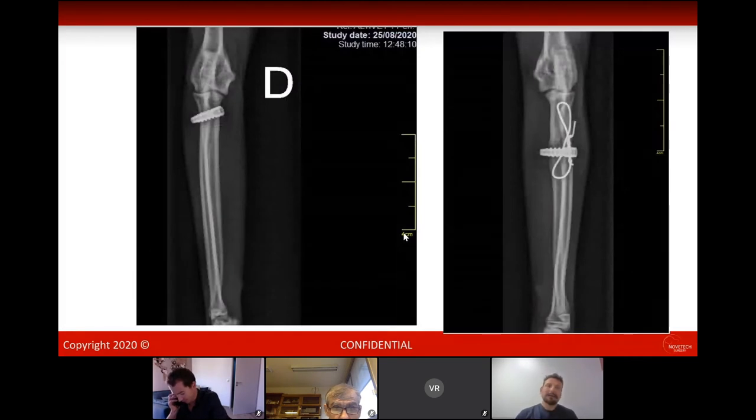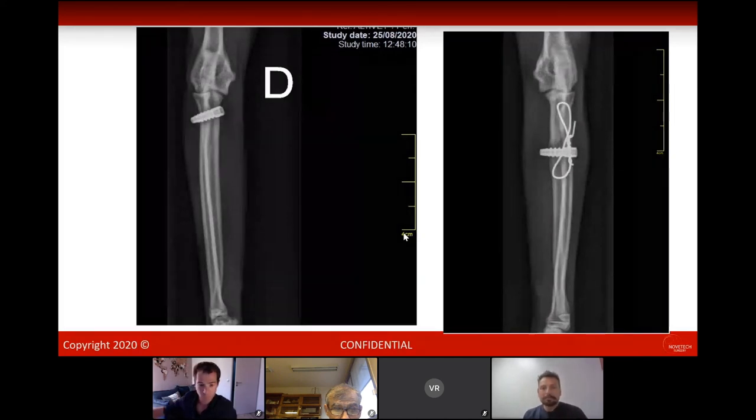As you can see on the right diagram, we have a little swelling of soft tissues. And we still have a little trouble when we touch it at 45 days. But it seems to be okay. So can you send the movie, please, Victor?